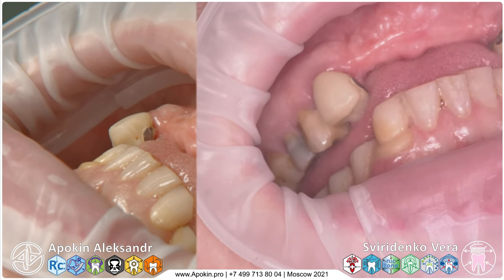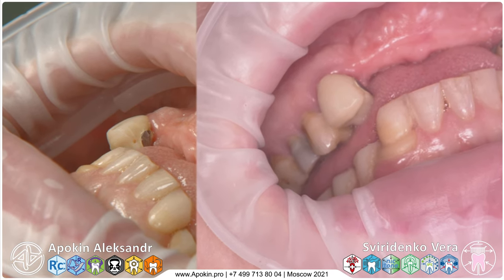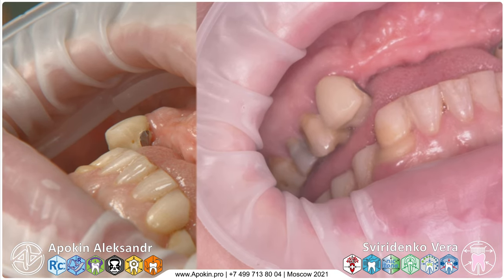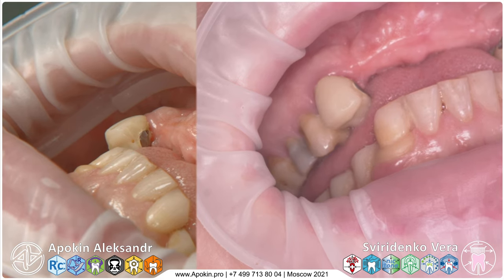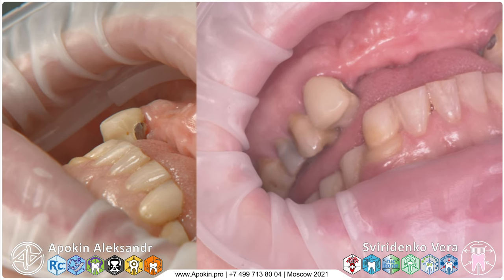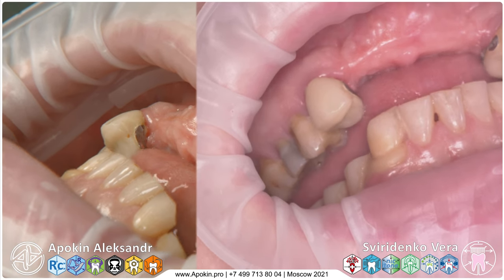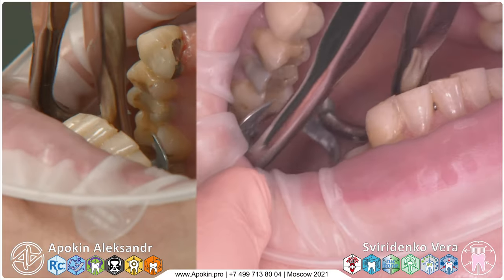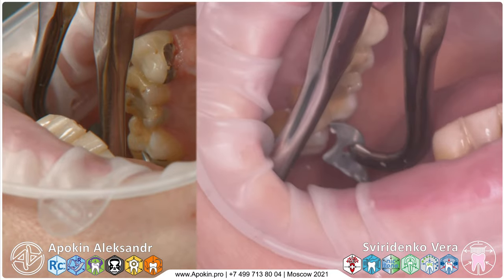We have, I think, a hard situation with the condition of hard tissues of teeth number 14, 15, 16 in the upper right quadrant. We're starting with the treatment of caries class 2, proximal surfaces, and we made infiltration anesthesia in this quadrant. Then we're testing the fit of our anchor clamps on tooth number 17.